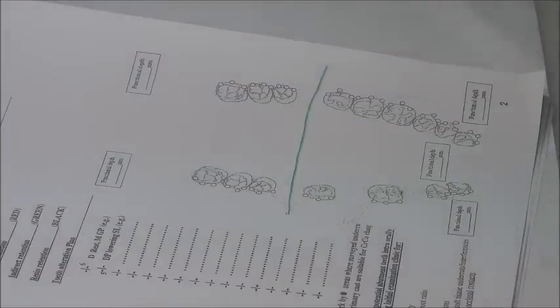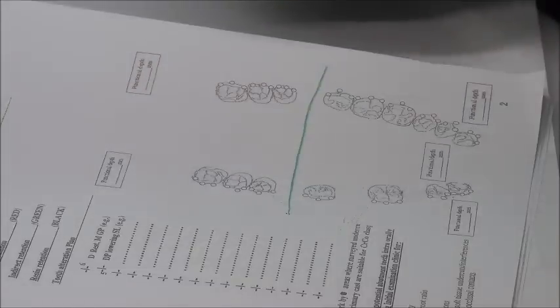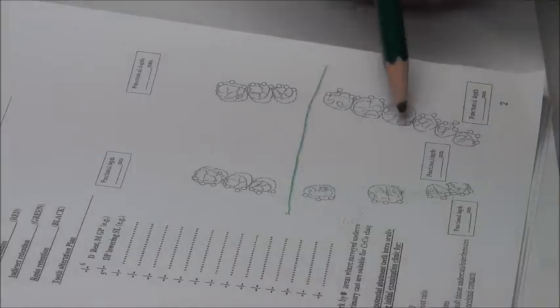Minor connectors. And the minor connector provides stabilization, because they can run vertically, right? So they prevent the denture moving. They prevent the denture moving laterally because they run vertically on the teeth. So the minor connector provides stability. What else provides stability? Reciprocal arm. And the body of the retentive arm. Okay? These provide us with stability. So we are distributing stability. So we are adding components for cross-arch stabilization.